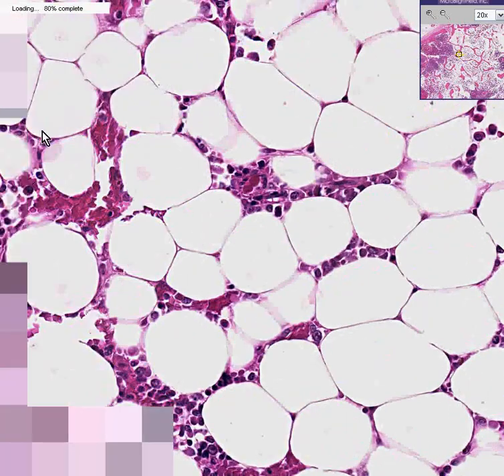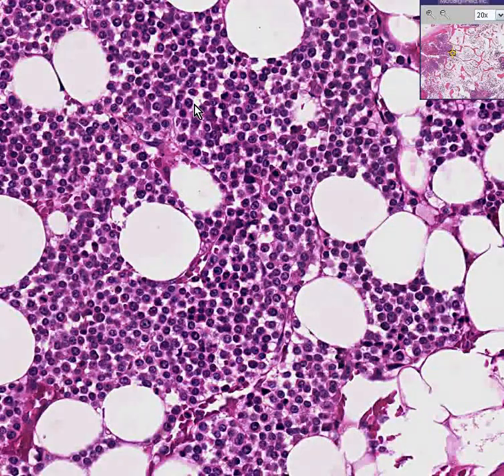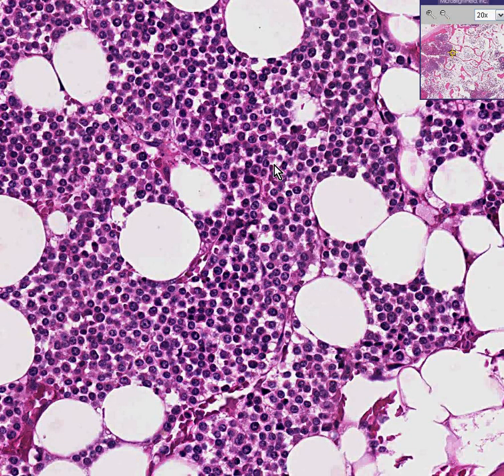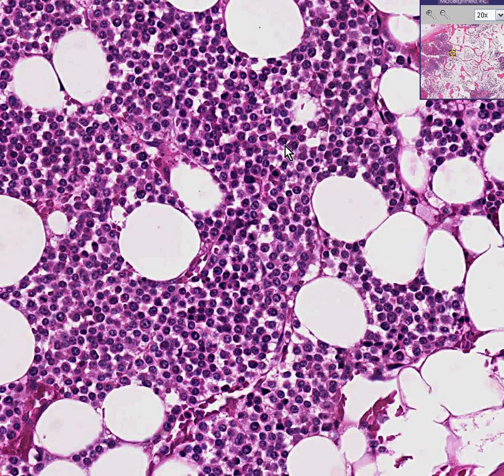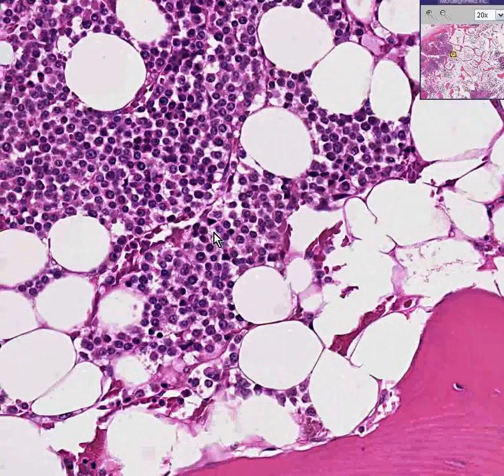As you go towards one of those lytic areas, and you were to pull out the textbook of what a plasma cell should look like, you could see that about 90% of these cells are plasma cells. There are about three or four classic features to a plasma cell: they have a round nucleus, sort of peripherally located. They have what they call cartwheel or spokewheel distribution of chromatin. And there's usually a prominent hof, or clear area, in the wider part of the cytoplasm, representing the Golgi apparatus, which is stuffed with immunoglobulin.